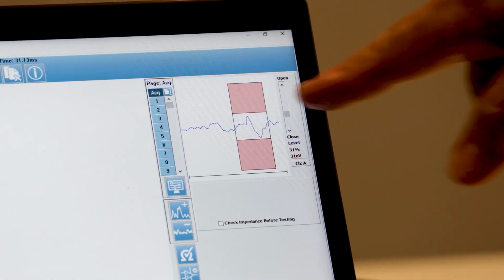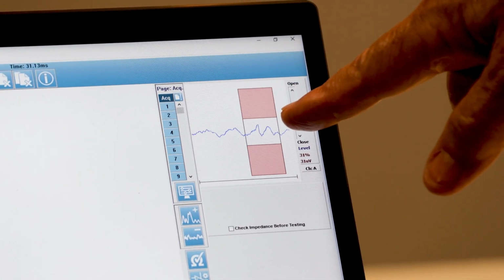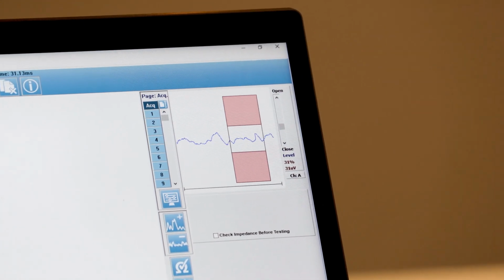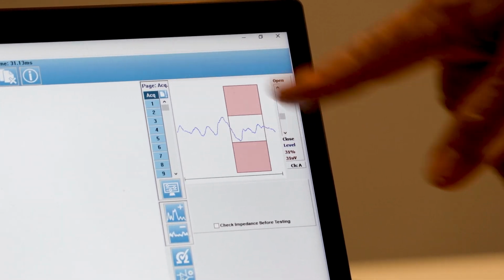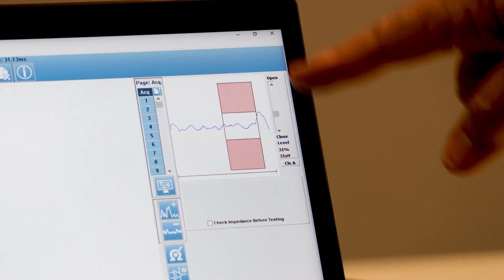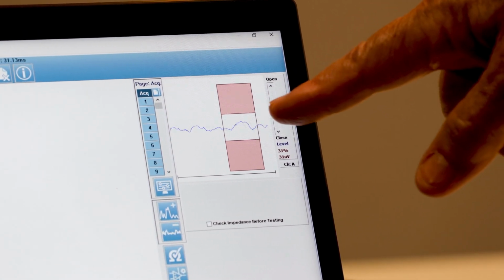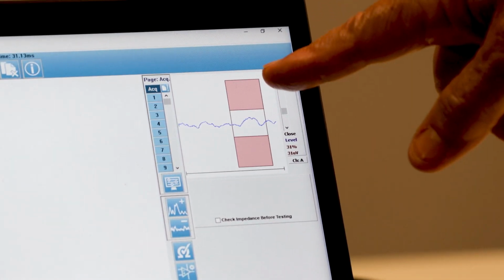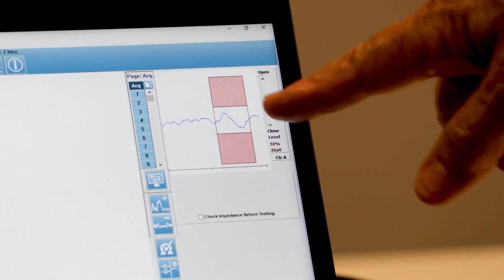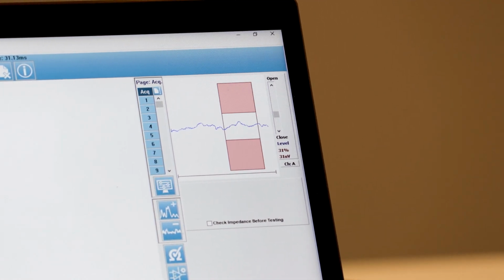So we're looking at the ongoing EEG that is being picked up by the electrodes, passed through the Audera Pro's amplifier, and then we're seeing it on our computer display. Right now, it's a little variable. It's still pretty quiet. We're falling within our acceptable artifact rejection range, but every once in a while you can see a bigger waveform pass through.